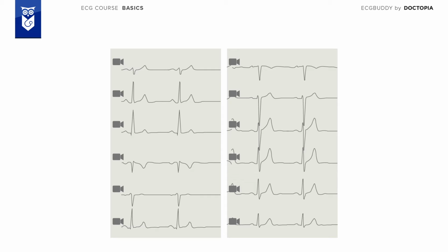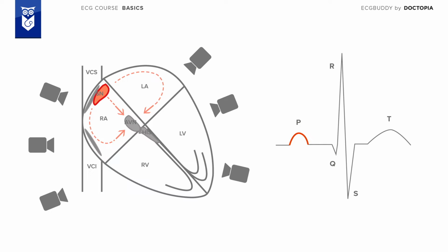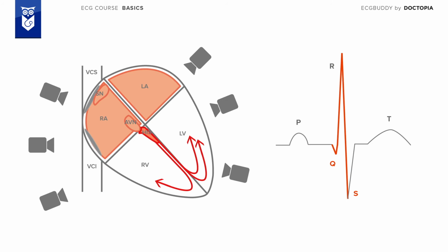Each lead is positioned at a certain point in relation to the heart and always remains in the same position. When interpreting the readout for a particular ECG lead, you must keep the position of the lead in relation to the heart and what this means in terms of the positive or negative deflection of waves and segments in mind. So, during an ECG examination, all 12 leads are showing the same change in excitation, but from a different angle.